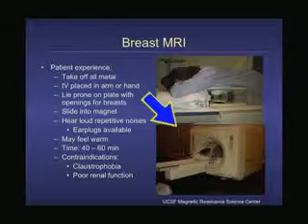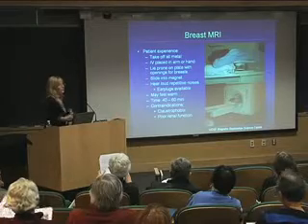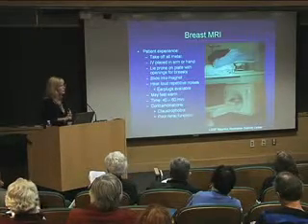Notice there's an IV pole here because this is the only modality that requires an injection, all right? That's the only way that MRI works, is by looking to see what takes up that contrast. So this does require an injection. It takes 40 to 60 minutes. If you've ever been in a magnet, it makes a lot of loud, irritating noises. You can put earplugs in, you can ask for a headphone, but again, the big contraindications would be claustrophobia, and you have to have good renal function. If you have really bad kidney disease, this contrast that we give can cause complications. So we check everybody's renal function with a lab test to make sure that their kidneys are working okay before we even give that contrast.